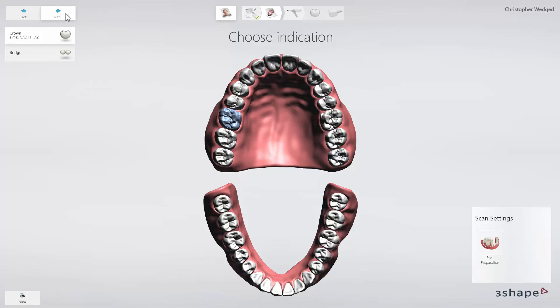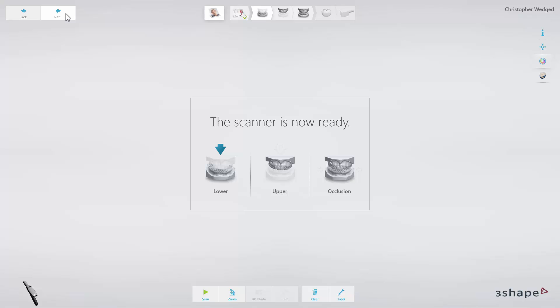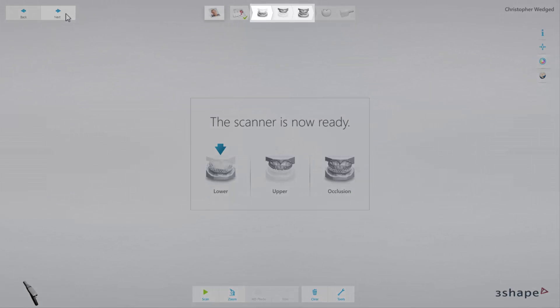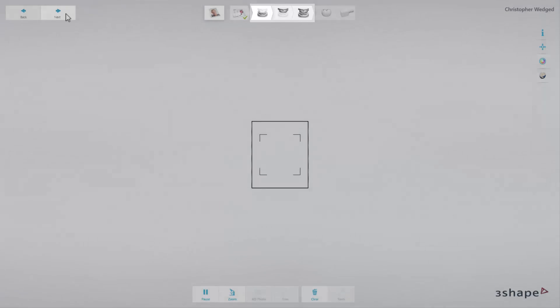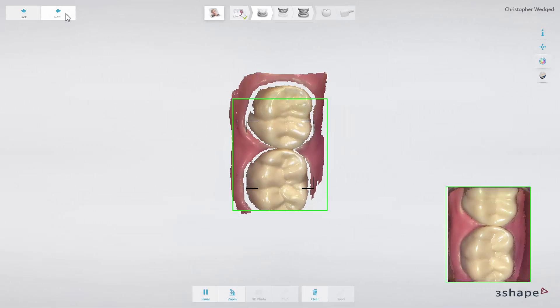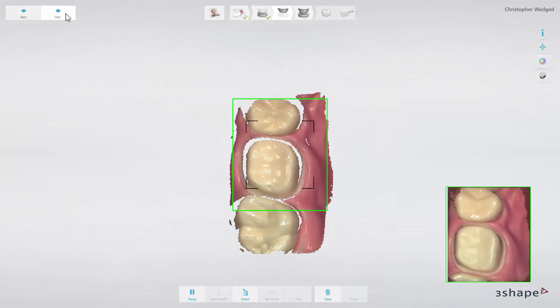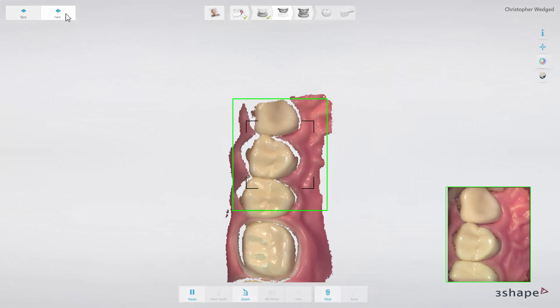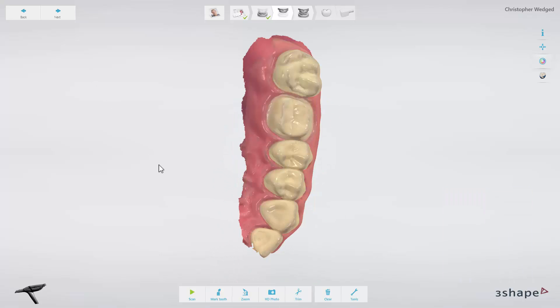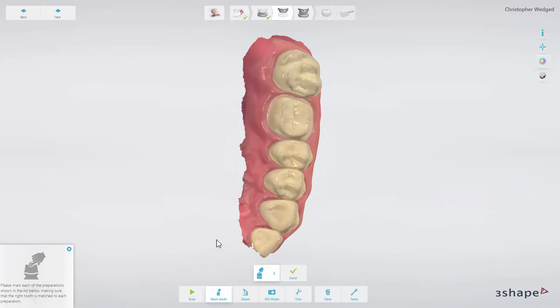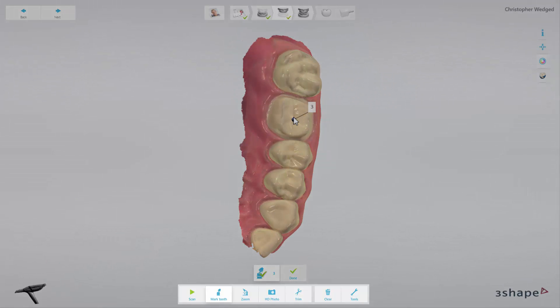The scanning module will start. When the TRIOS module is open, the scanning icon is divided into scanning workflow steps that may be necessary for a given restoration. You can scan in any order. Always remember to mark the tooth on which the restoration is planned. Working with the TRIOS scanning module, you can use all the tools available for the TRIOS application.